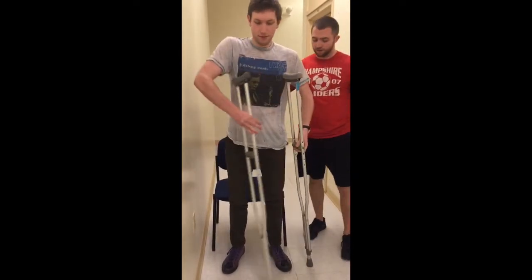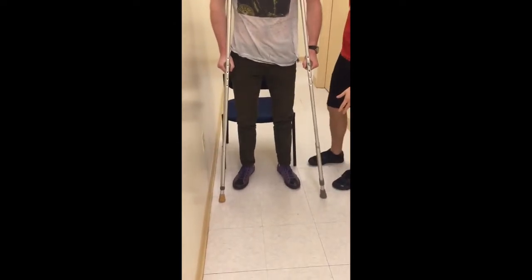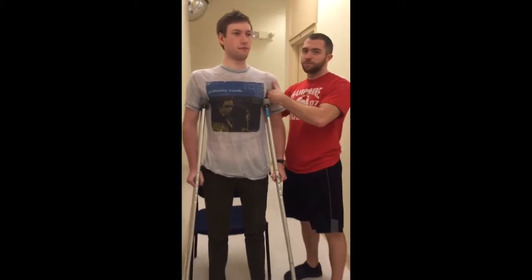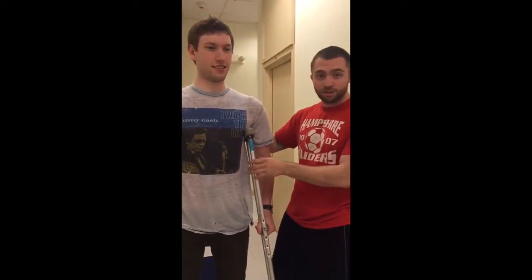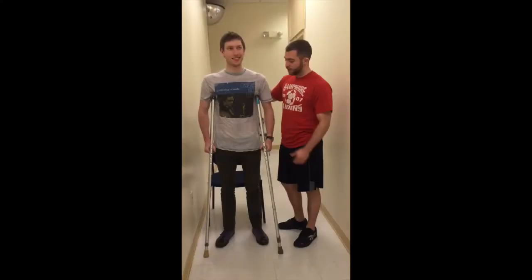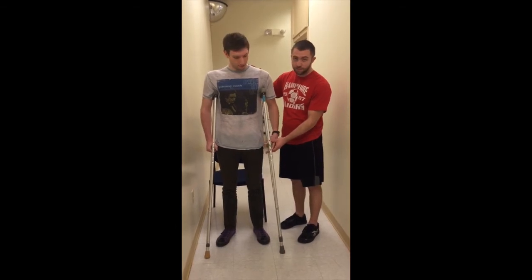Take that crutch, put it on your other side. Perfect patient. 6 inches at a 45-degree angle, anterolateral from that toe. Then I'm going to come under. Perfect fit. Now we are set for ambulation. Okay? We made sure that those crutches fit. We checked again. So while Will's in standing, we're also going to check another way just to make sure that the hand grip is at the right height.